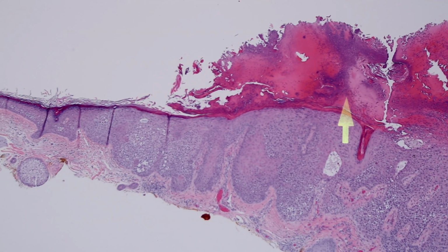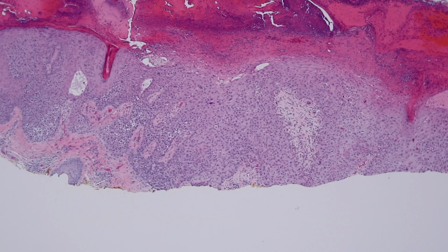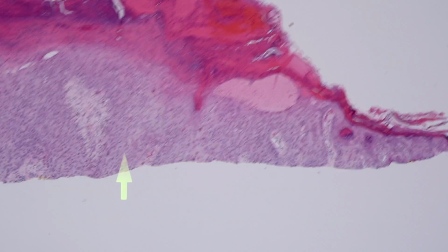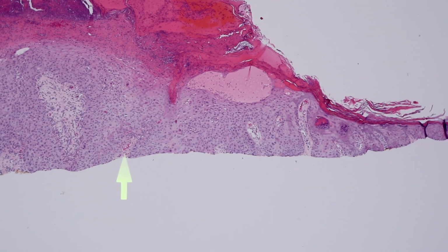Again, here you've got your in situ carcinoma, filling the epidermis, some pagetoid spread, and then look what's happened. It suddenly gets more glassy, and it's because it's starting to go into invasion. And there's probably invasion underneath. But again, if you have this where it's transected, you might say, well, I know that's squamous in situ. It's full thickness atypia, and there's pagetoid spread, but I really can't tell what it's doing down below because it's transected. So this is a time where if I only had this, I would say squamous cell carcinoma, at least in situ. I'm convinced this is carcinoma, but I just can't tell if it invades or not. So I say, well, I know it's at least in situ, and I can't tell if there's invasion or not because it's transected. So that's the way I word that.